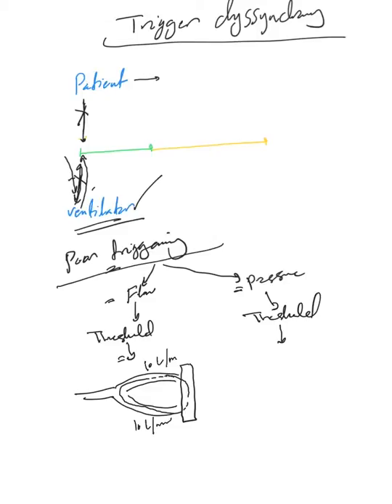Now when the patient breathes, the patient takes a certain amount, so in the expiratory limb it will be less, let's say, for example, 7. So based on the threshold, you put maybe 3 liters at least difference. So 10 here, it has to be 7 here and 3 sucked in for the ventilator to be triggered.